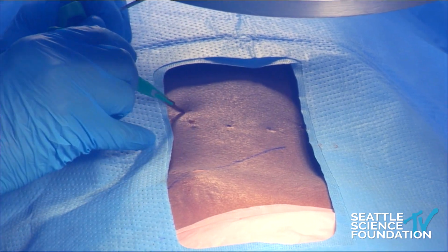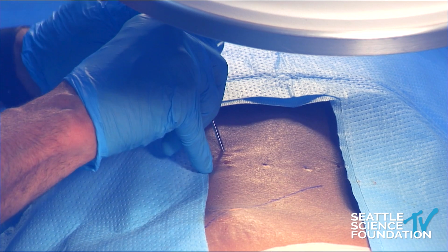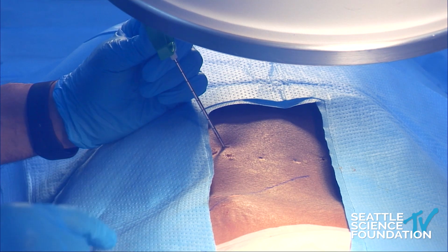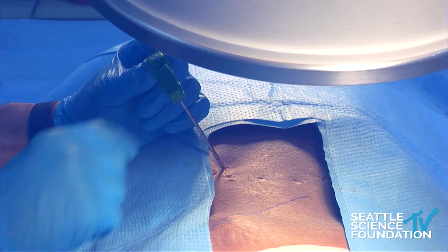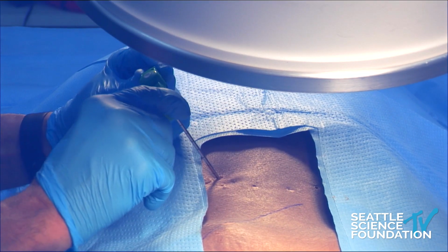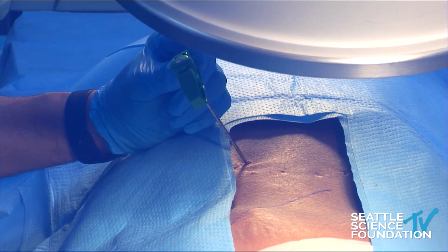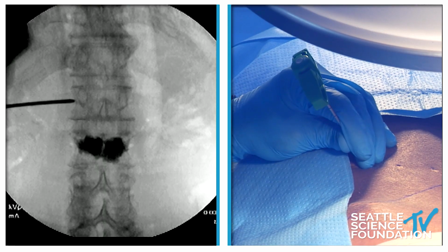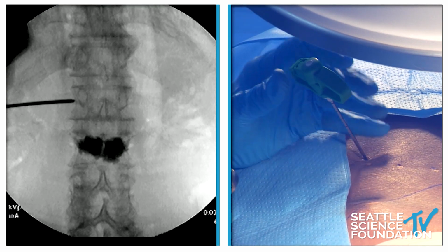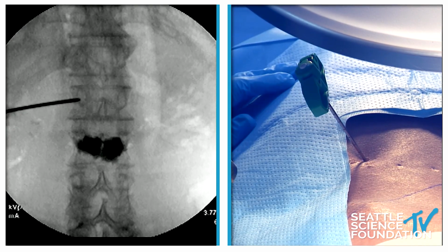The SpineJack is a different device. It's an expandable titanium alloy implant. This was developed in France and was popularized and brought to the market by a company called Vexim. And this is a different approach. As you'll see, instead of the 10 o'clock and 2 o'clock approach, I'm starting very flat. So this is more of a 9 o'clock and 3 o'clock approach. We want it to be flat because we also want the skis of the SpineJack to be parallel to the fracture.